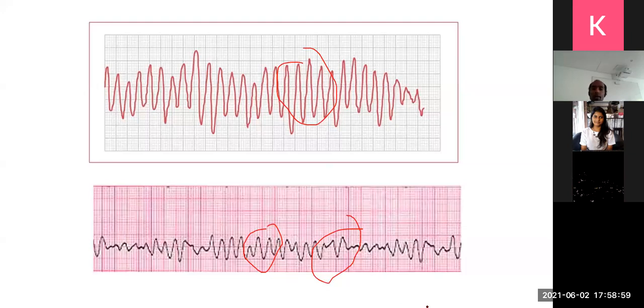This is called polymorphic VT because it's regular, but some are tall, some are short. This is called polymorphic VT. And this is VF. Right?